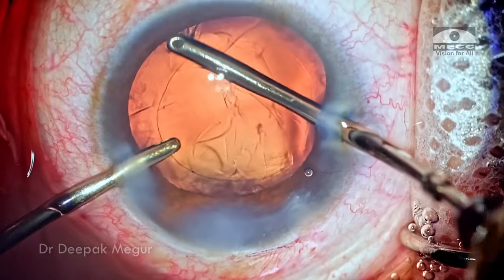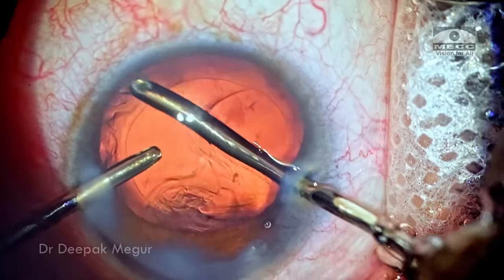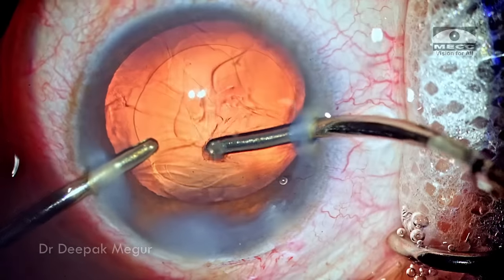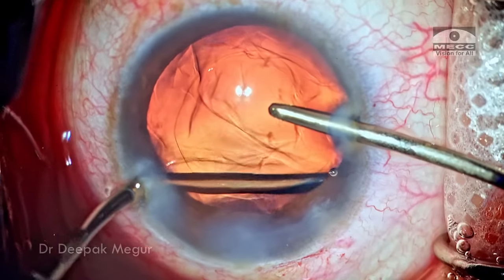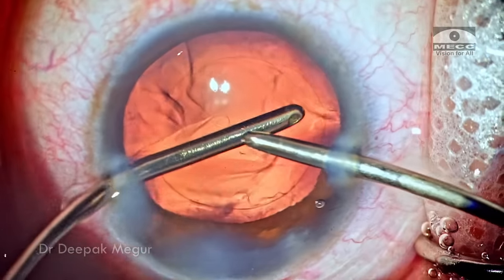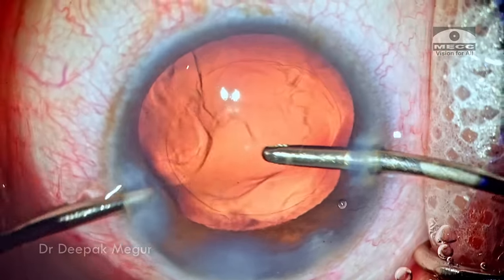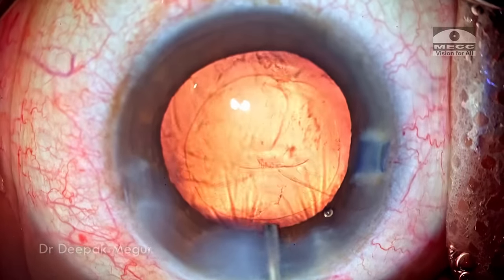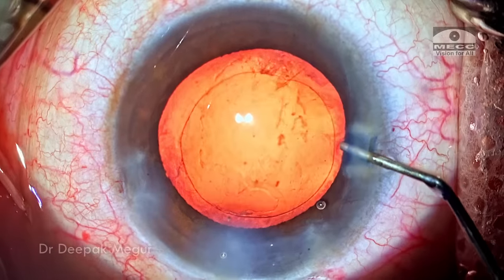I'm using bimanual irrigation-aspiration to perform cortex aspiration. We need to be mindful that in long-standing cataracts with very hard nuclei, the bag and capsule will be slightly fragile. We need to be careful when aspirating the cortex because we did a good job until now and shouldn't compromise it by breaking the posterior capsule. The posterior capsule is flushed with BSS to clean off any remaining fibers, and the capsule bag looks clean and nice.